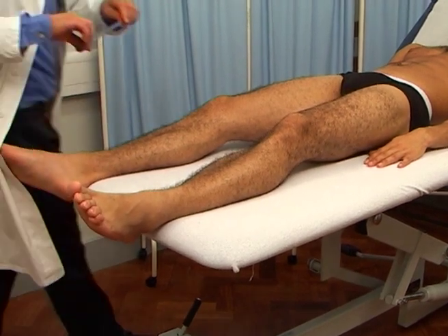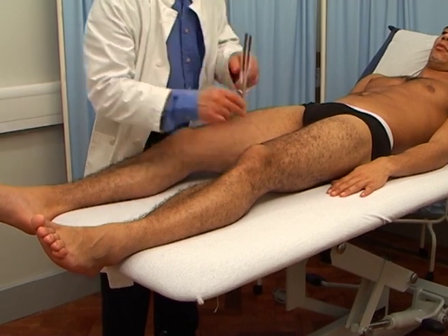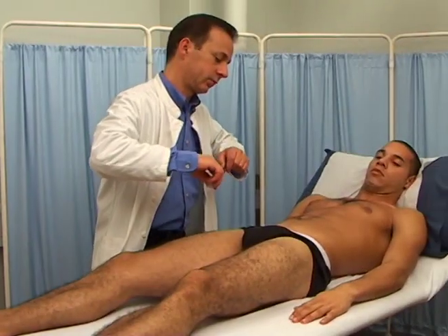If vibration sense is reduced or absent, then test over the malleoli, then to the patella of the knees, then move up to the iliac crest if necessary.